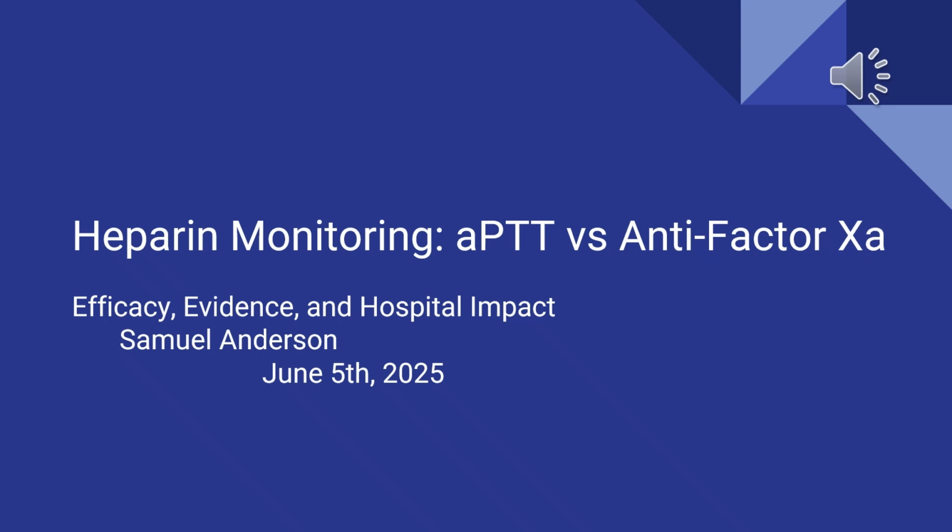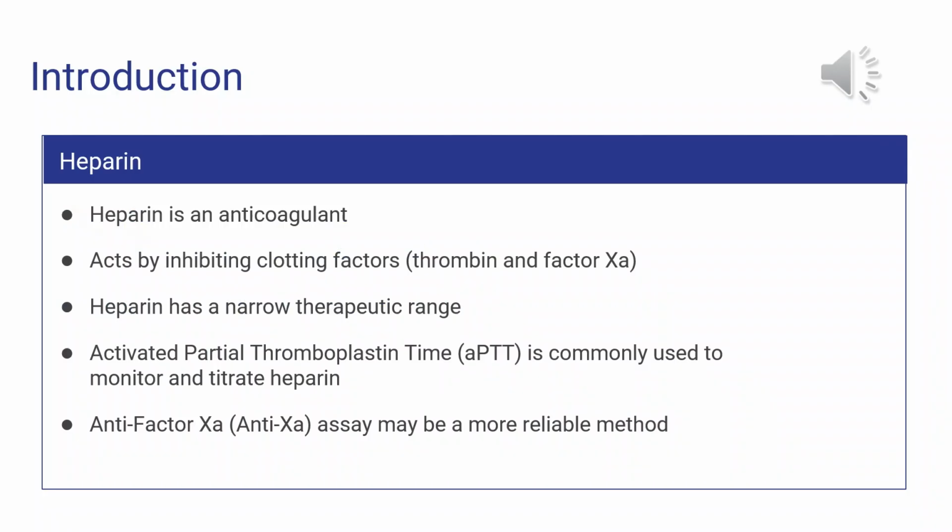Hi, my name's Sam Anderson, and my project is on heparin monitoring and dosing using the aPTT versus the anti-factor Xa assay. Okay, firstly, I want to talk about heparin.